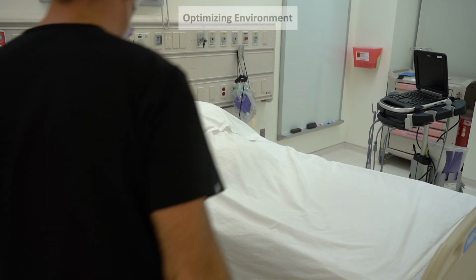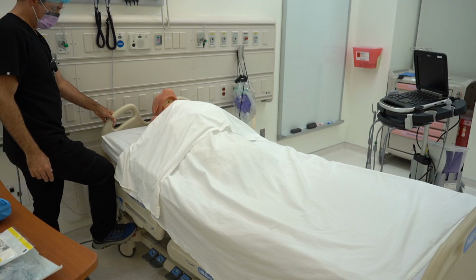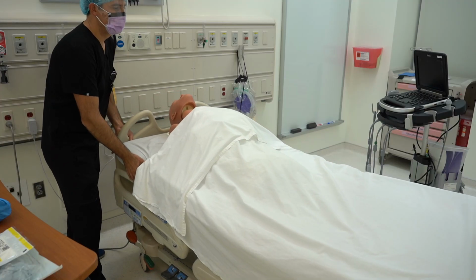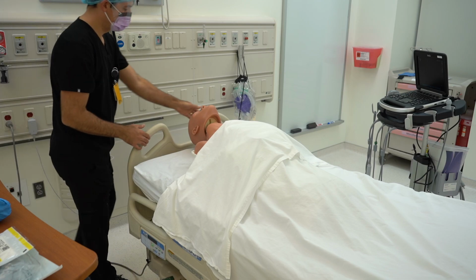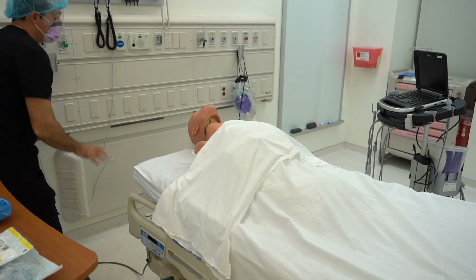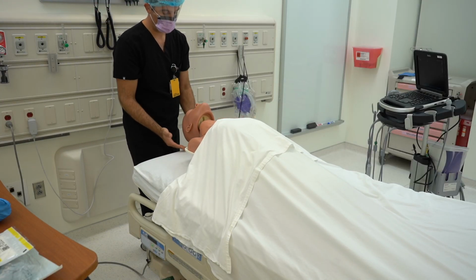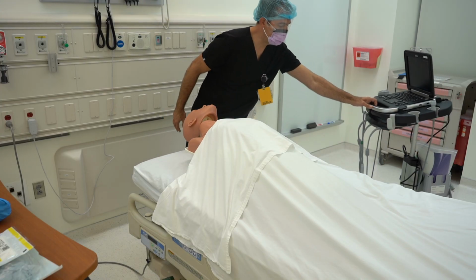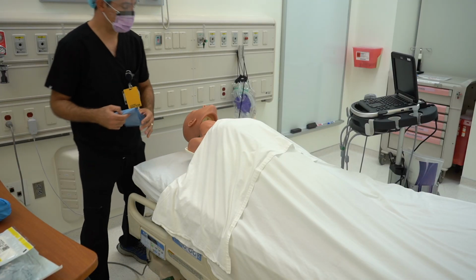Now, as we're optimizing the environment, we're trying to essentially make space at the head of the bed for us to operate. So we'll shift the bed off the wall, assure the bed is locked into position. We'll remove the headboard. We're going to desire to have the patient shift up as close to us as possible. And sometimes this can be challenging with a particular bed utilized. We're going to want to make sure our ultrasound is within view, typically on the opposite side of the bed if I'm doing a right IJ approach.